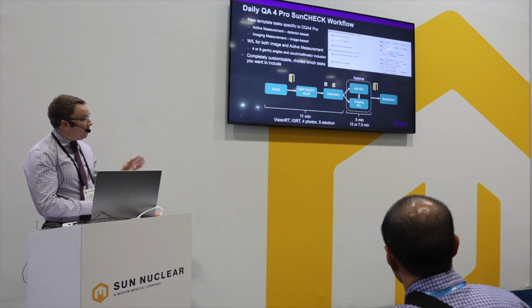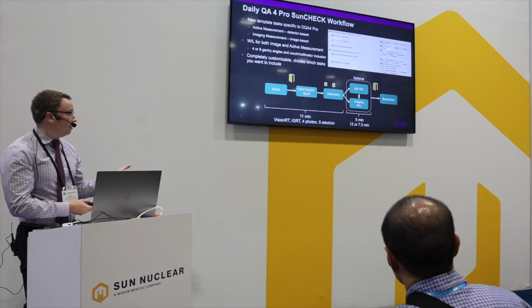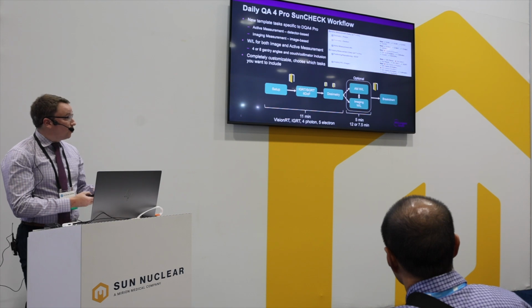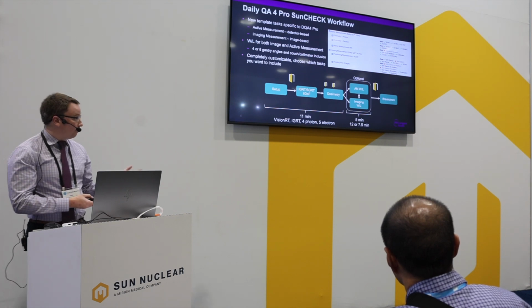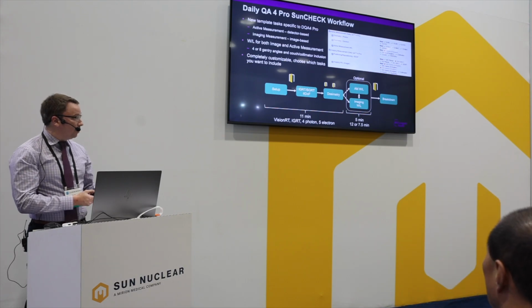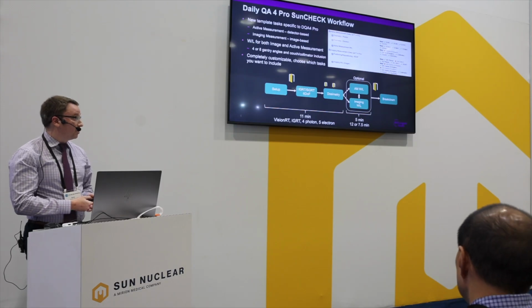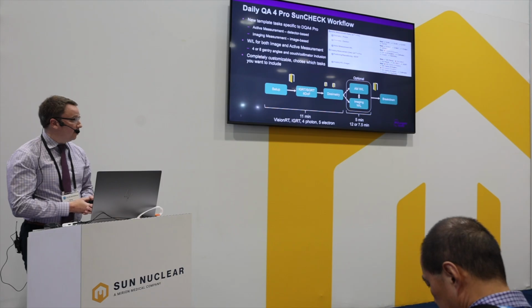After you're done with that, you have a choice where if you want to do a Winston-Lutz test, you can use either the active measurement, or if you want more in-depth information, you can do the imaging Winston-Lutz. And the active measurement, because of those automations that Raj mentioned, you can do in about 5 minutes with really one button click. For the imaging Winston-Lutz, it's a little bit longer because it can't be automated, you'll see in a second. And so that one is 12 minutes, or if you have developer mode, I've written a script now that completely automates the delivery, and you're able to do it in only 7.5 minutes.